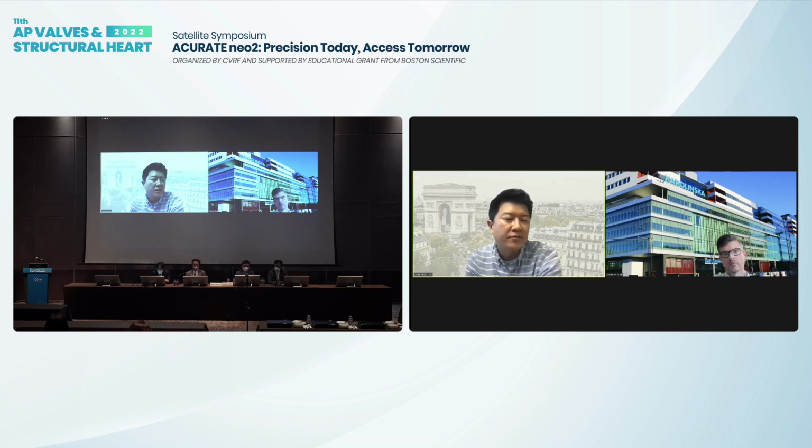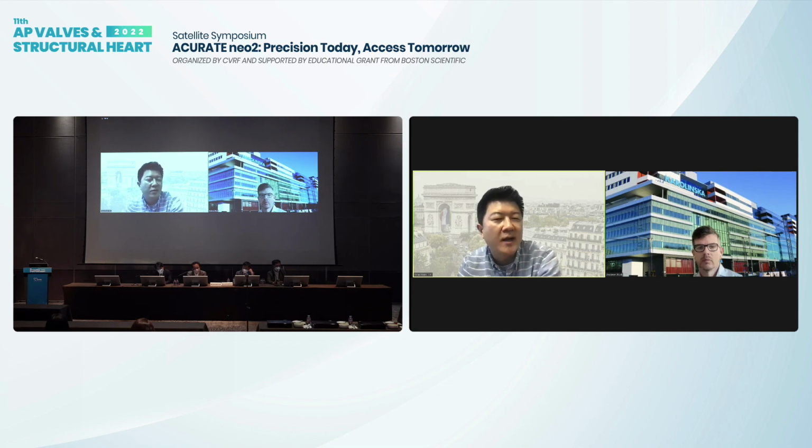So you might have to figure out which position the third device will take. But especially in terms of long-term management, and if the numbers of patients increase also in Korea, and if you try to treat patients that are younger with lower risk and higher life expectancy, I think the aspect of coronary reaccess will also become very relevant. I've shown you one example, but we have data that using the CoreValve, the Medtronic platform, the risk of no reaccess is actually very high. Yeah? And we know it from all the data that we have seen.